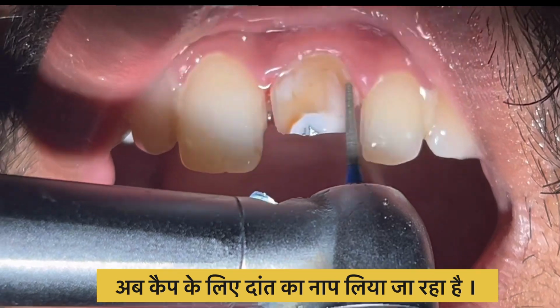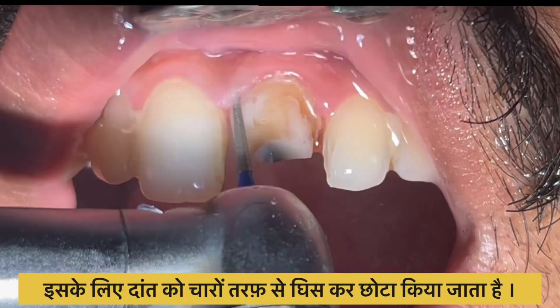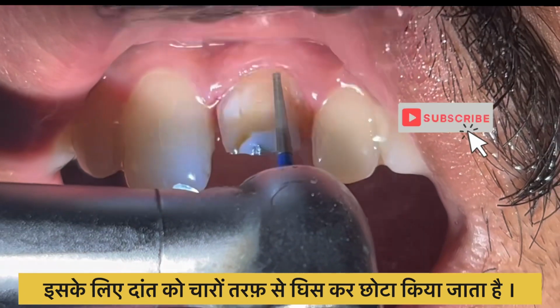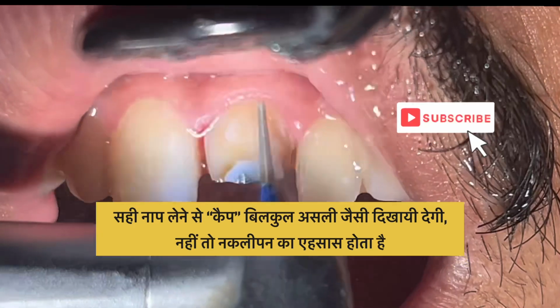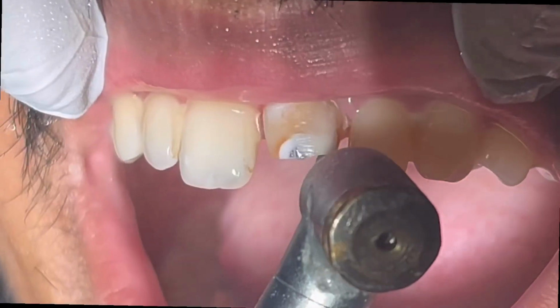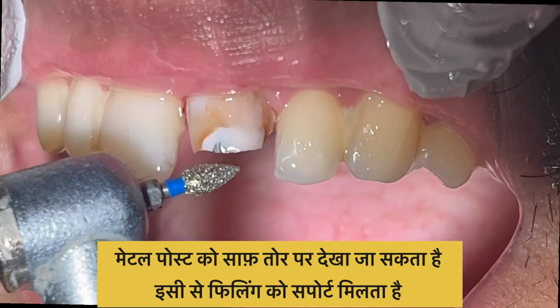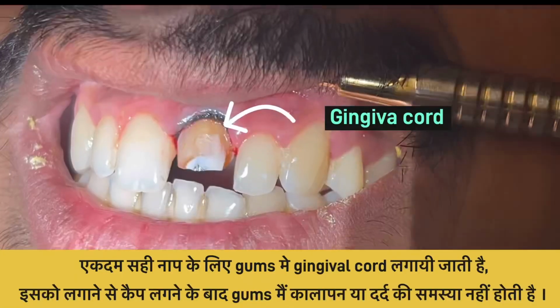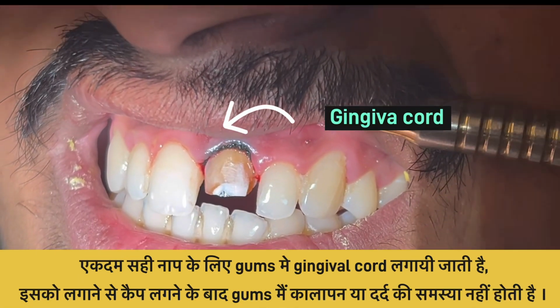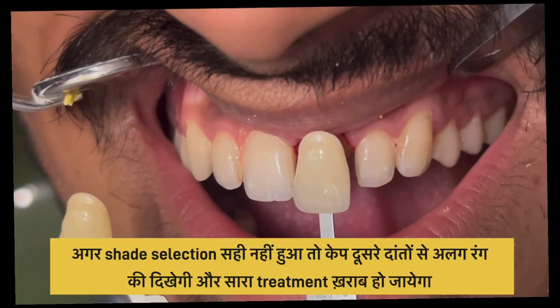We are now preparing the tooth for a cap by gently shaping it from all the sides and then taking an impression to create a perfectly fitting cap. And to ensure a proper fit and prevent discoloration or blanching, a gingival cord is placed in the gums before taking the impression for the cap.